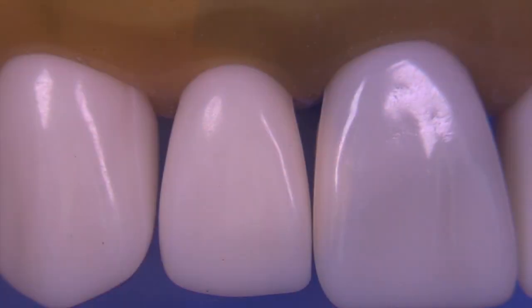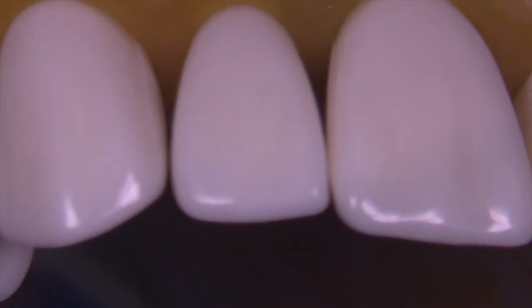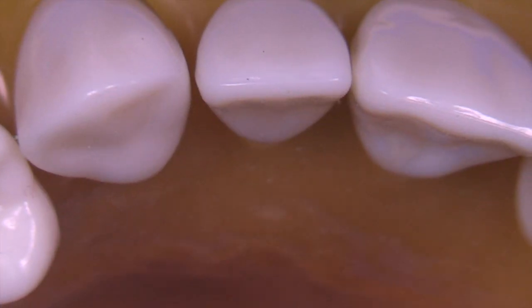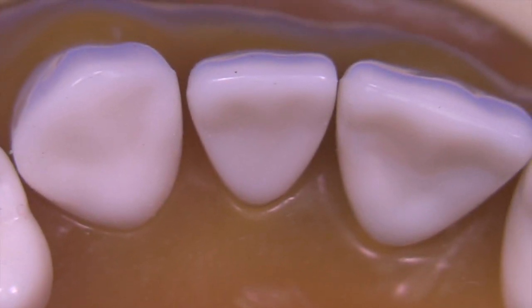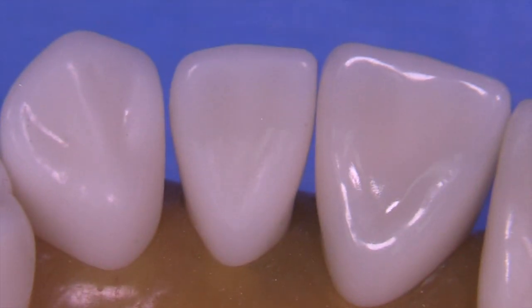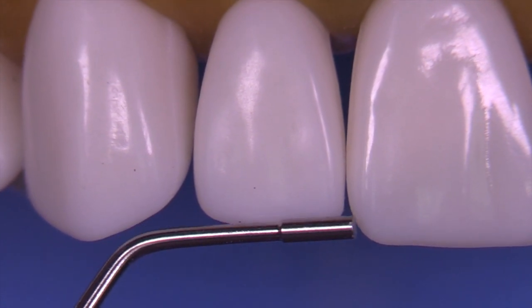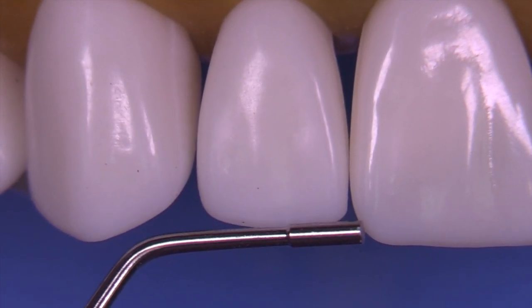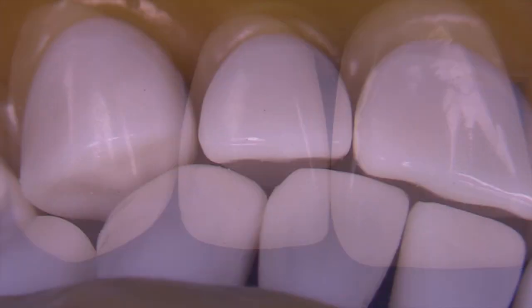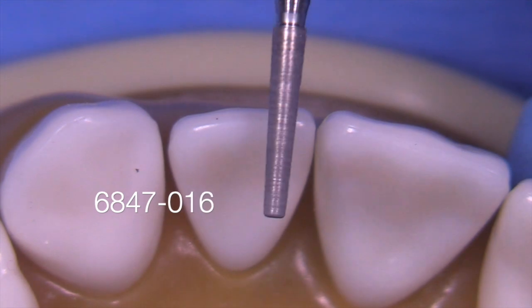The PFM for the lateral is a little bit different from the central — namely that it's a shorter tooth, approximately one millimeter shorter or maybe a little less. So when we have the final preparation completed relative to the adjacent central, it should be approximately three millimeters shorter than the existing incisal edge. Always look at the tooth in occlusion and always look from the side — the critical view.